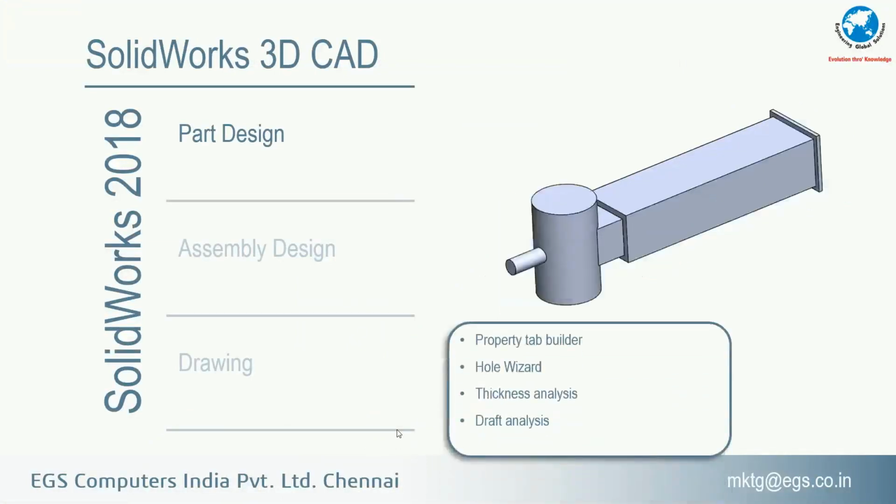In part design, we have the property tab builder where we can assign the properties of each material, so that once we have drawn it and sent it to manufacturers or the users, we can easily track it down. And hole wizards, where standardized holes are available through which we can align holes, and we can also request the suppliers to provide specific dimensions. Then, when we are manufacturing this drawing, we can analyze the thickness and draft for the manufacturability or the feasibility of the design for manufacturing.